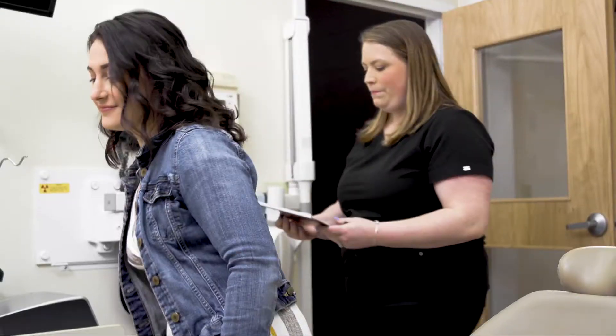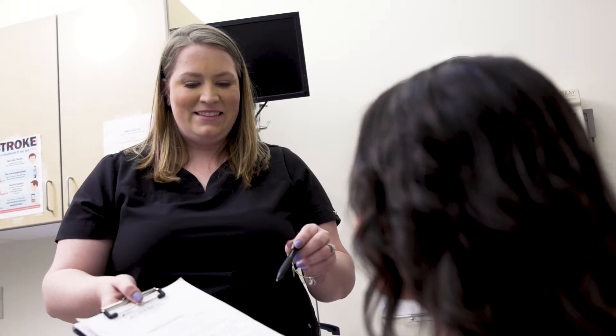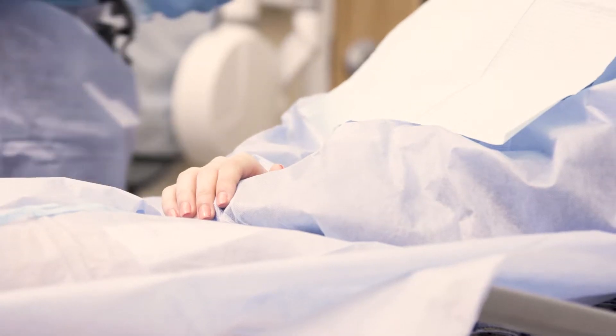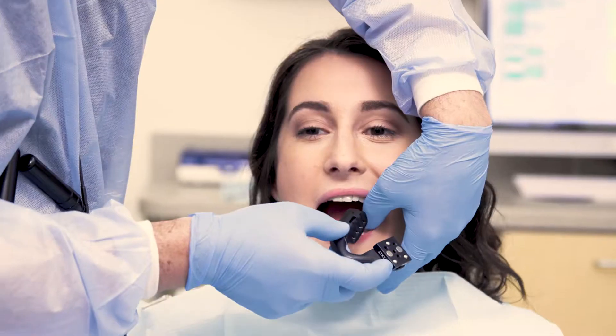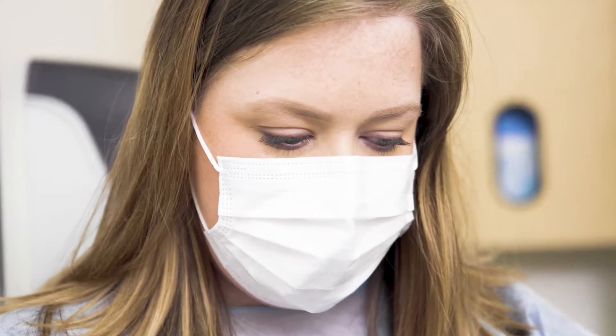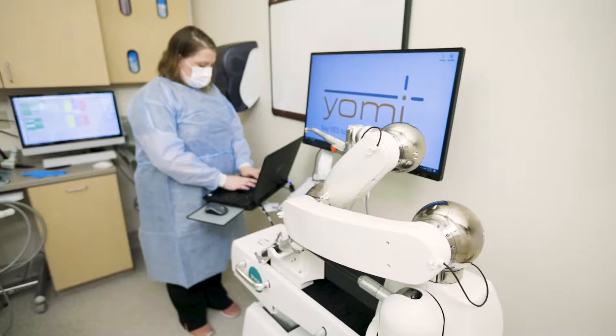The first thing we're going to do is seat the patient, go over all of our pre-ops, go over our consent forms, then we're going to temporarily place a splint on the opposite side of where we're working. This splint is going to allow us to register with the CT.